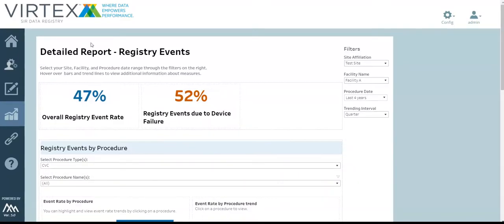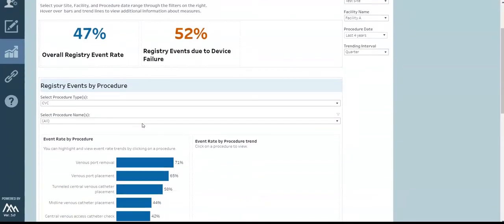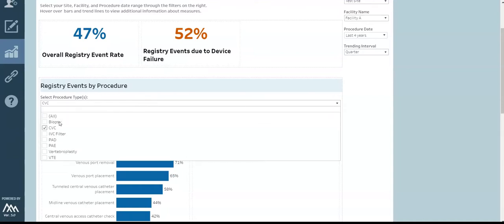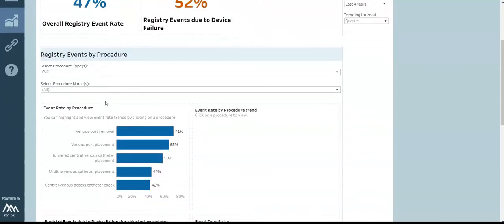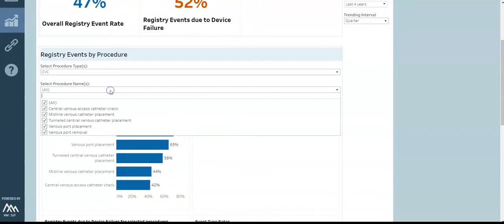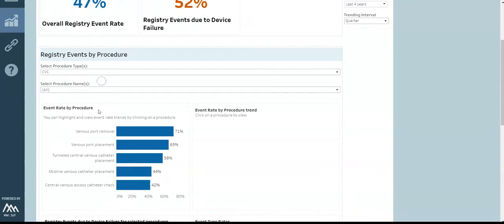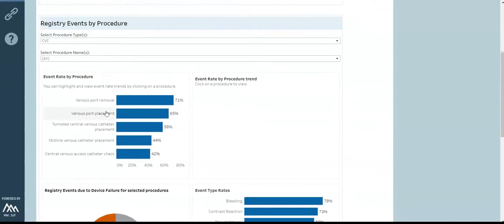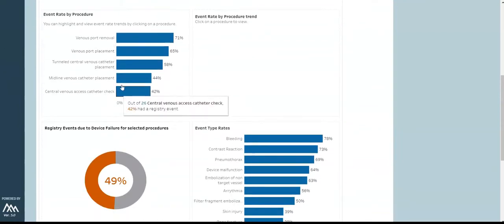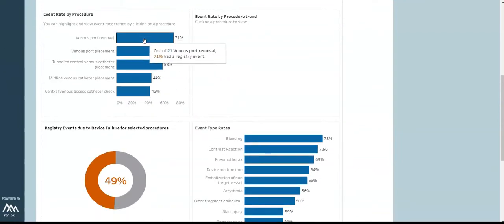This is the detailed report for registry events. Registry events are intra-procedural complications. Here you can see high-level metrics about how your site is doing, as well as filter by specific procedure types and names. Once you've narrowed down your data set, click on the bar chart to see how the registry events trended over time.